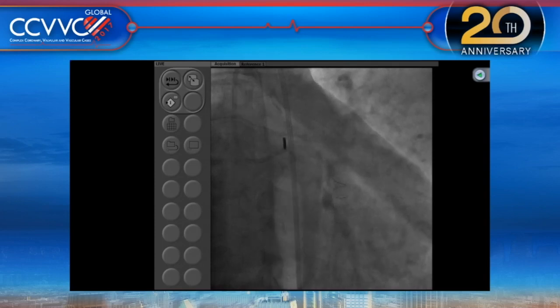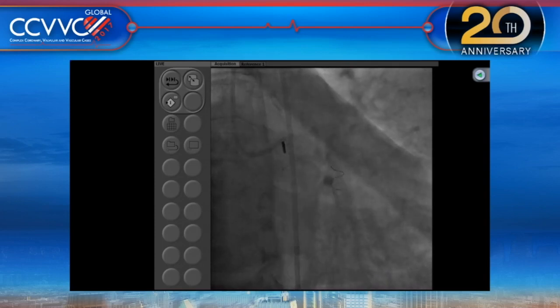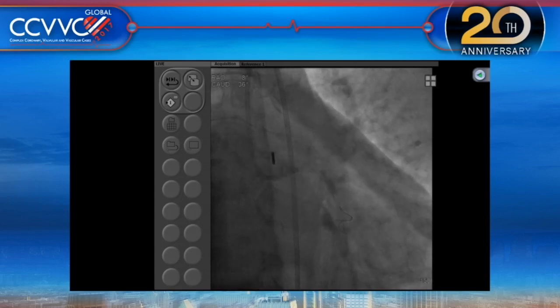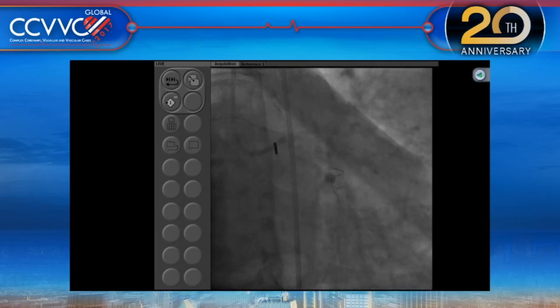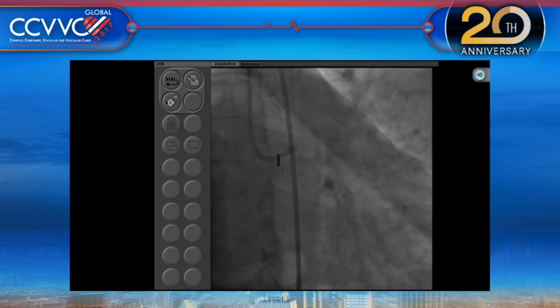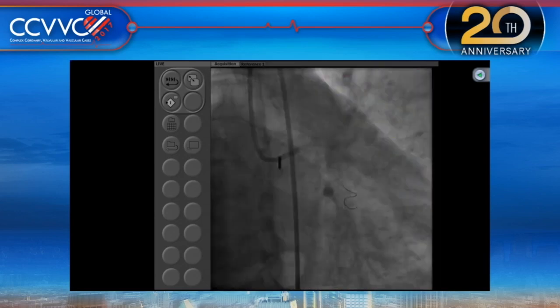Yeah. No, but if we need to do, let's see, because if we need to dilate the ostium of the circ a little bit. Would you dilate the ostium of the circ before you start rotational atherectomy in the LAD? So a little balloon there, and then use maybe a 2 burr from left main to the proximal LAD. I think if you dilate, we may lose the circ. Could you show the other view of the circumflex, because that showed that proximal lesion much better. Yeah.